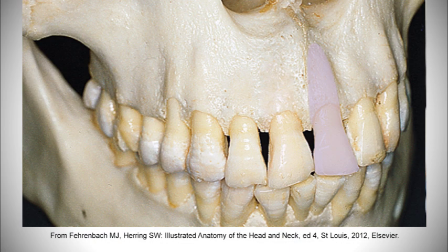The supraperiosteal injection, commonly referred to as local infiltration or field block, is generally recommended for anesthesia of individual teeth and associated periodontium, as well as facial or lingual soft tissue. It is not recommended when several teeth in the quadrant need to be anesthetized.